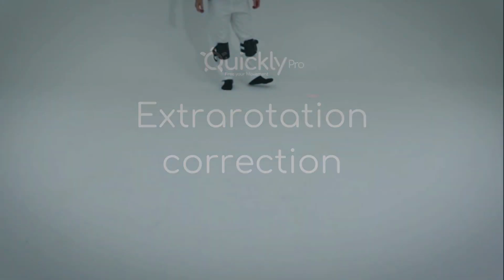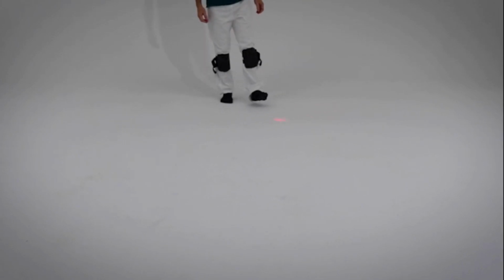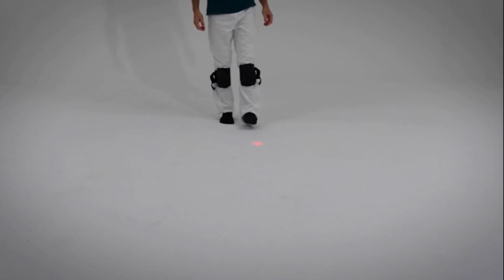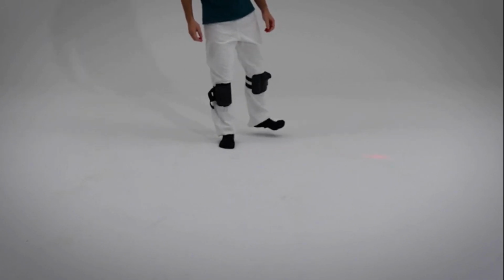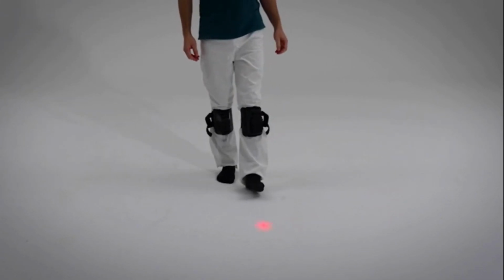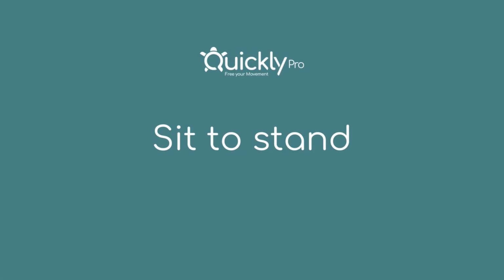Extra rotation correction. In patients with an extra-rotational attitude, the use of feedback can help to increase awareness of the body's attitude. The patient is required to correct the pathological attitude by trying to maintain the feedback along a straight line by performing an intrarotational movement during the advancement of the step.